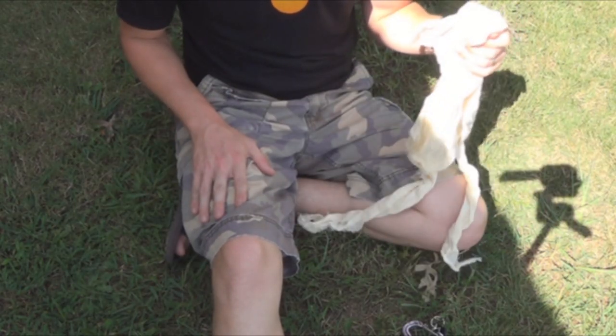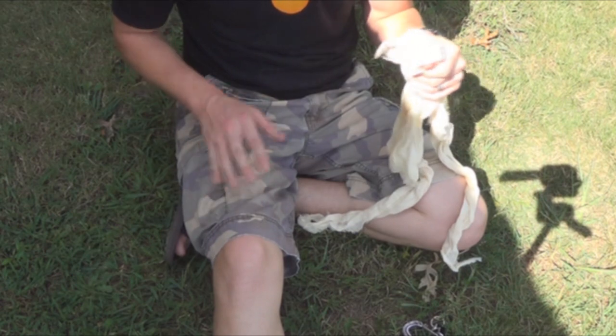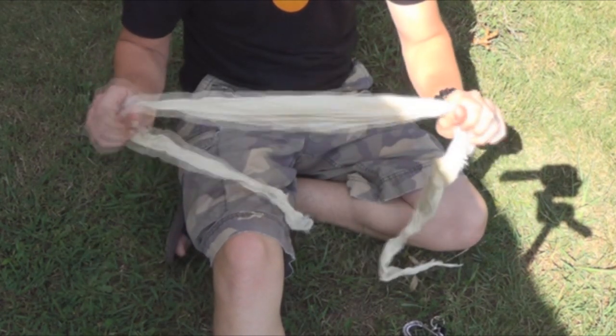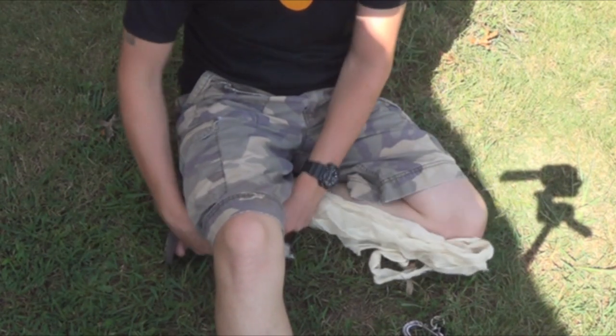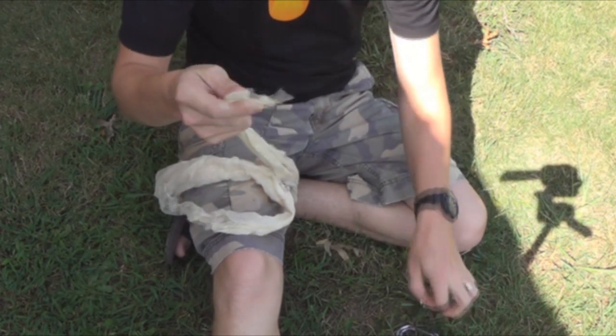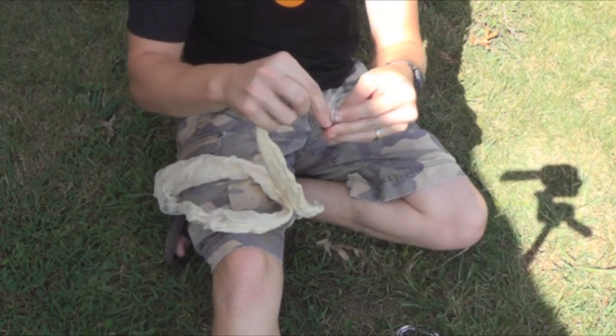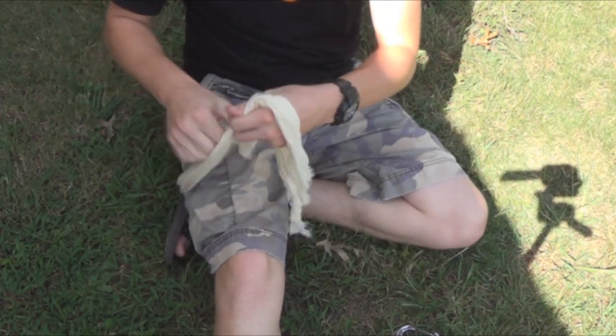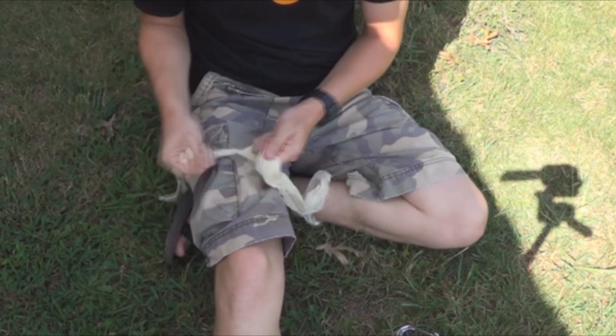We are going to pretend like the injury is to this leg. You want to get your tourniquet several inches above the actual injury and try to make this cloth as wide as you can possibly get it. Take your keys, loop it through, and tie just a simple overhand knot.